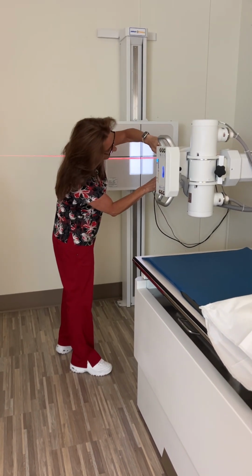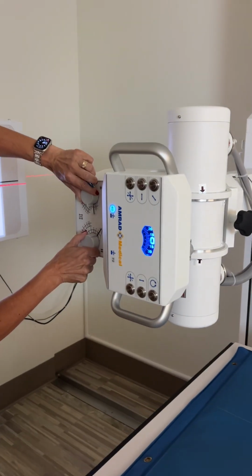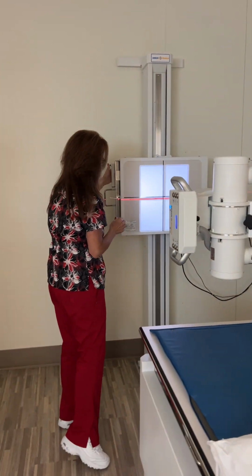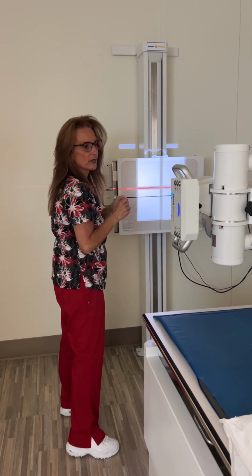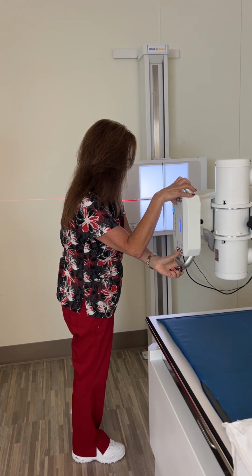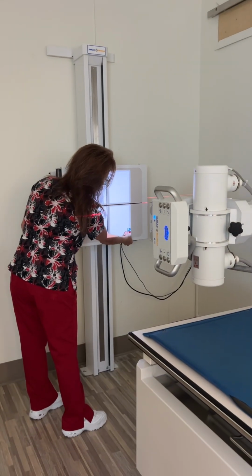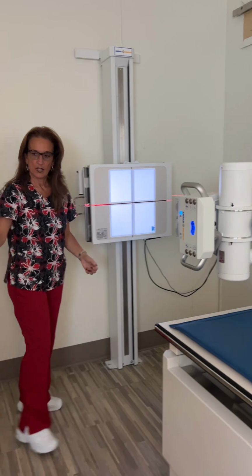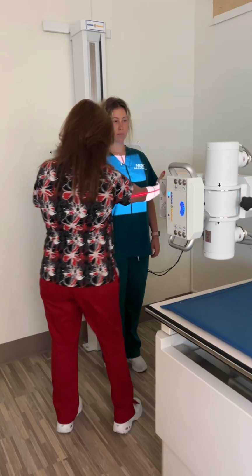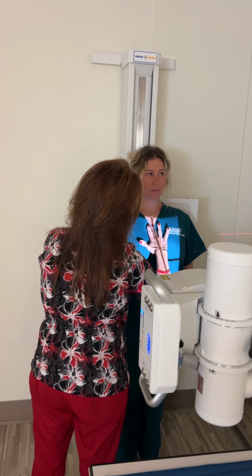All right, so we came into 40-inch SID, and we are still going to go 14 by 17 on this. Come down a little bit, I think. And now the patient's going to be facing out, so left side will be this side. So marker goes down in the left lower corner. We'll bring you over here and put your back against the board for me. Stand up nice and straight. Get you in the middle. So I'm making sure she's in the middle.